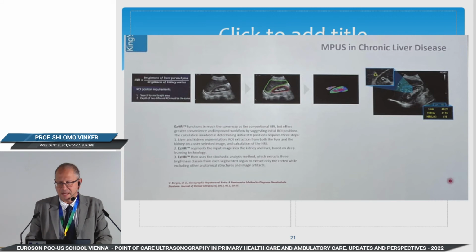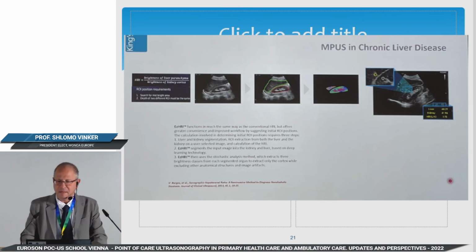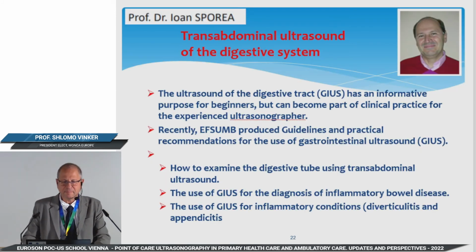And this is another technology, again, that makes the diagnosis of liver and hepatic findings more accurate.